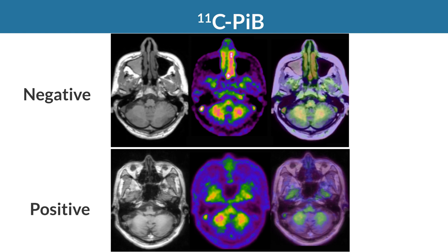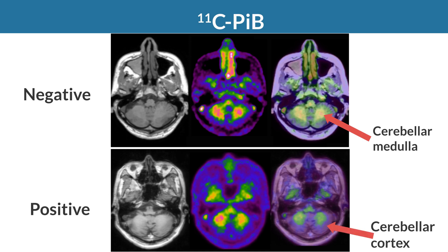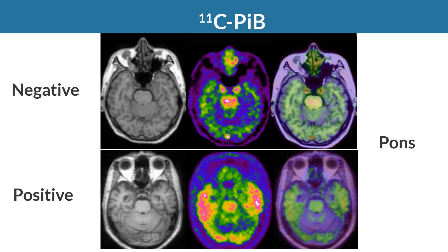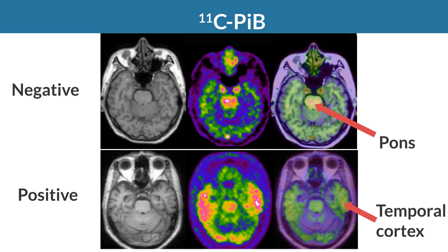Amyloid negative and positive findings in carbon-11 PIB PET at the cerebellar level: cerebellar medulla shows high accumulation in both negative and positive cases, while cerebellar cortex shows very low accumulation in both. At the pons level, pons shows high accumulation due to high white matter content in both cases. Diffuse accumulation in cerebral white matter is observed without any cortical accumulation in a negative case, whereas temporal cortex shows high accumulation in a positive case.